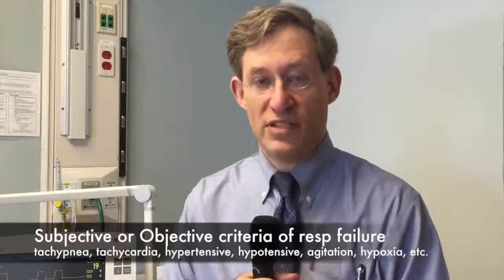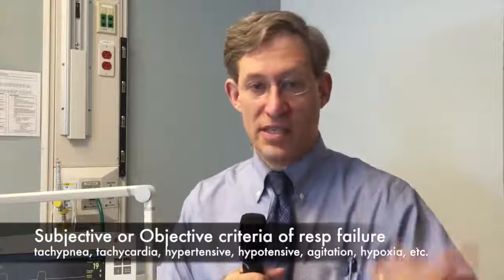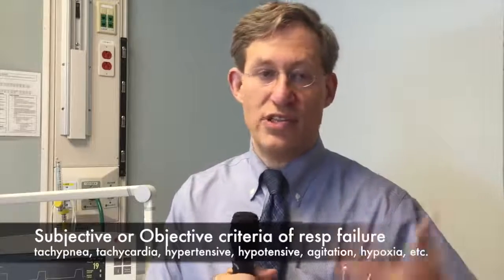Usually we'll watch a patient for 30, 40 minutes or so, and if they're comfortable and they don't appear to have either subjective or objective criteria of failing, including becoming tachypneic, tachycardic, anxious, agitated, hypoxic. The idea here is if the patient looks good after 30 or 40 minutes and you check an arterial blood gas and they don't show evidence of either hypoxemia or hypercapnia or acidosis, then the patient should be extubated. This is the concept of a spontaneous breathing trial. We're not slowly weaning patients from the ventilator as was done 15 or 20 years ago.